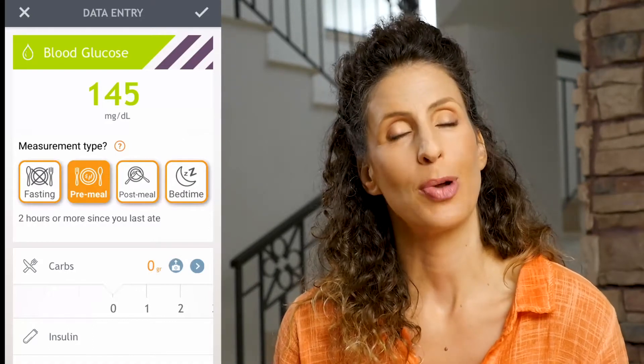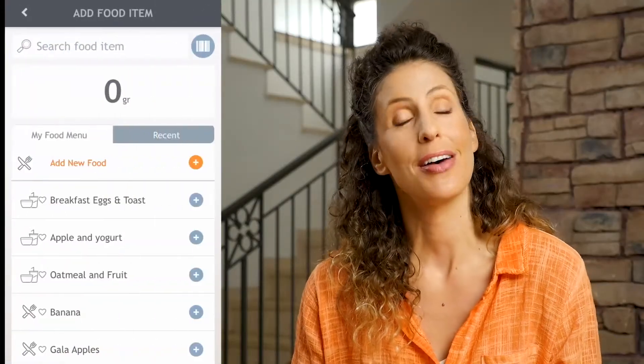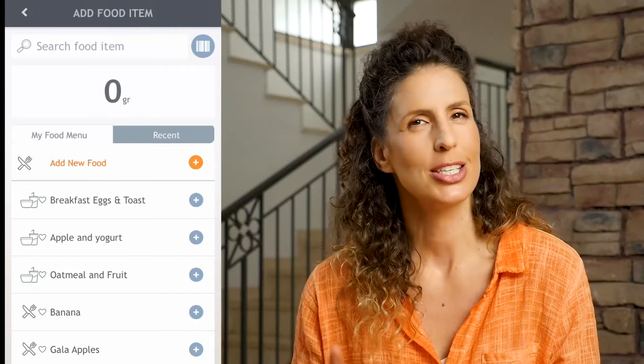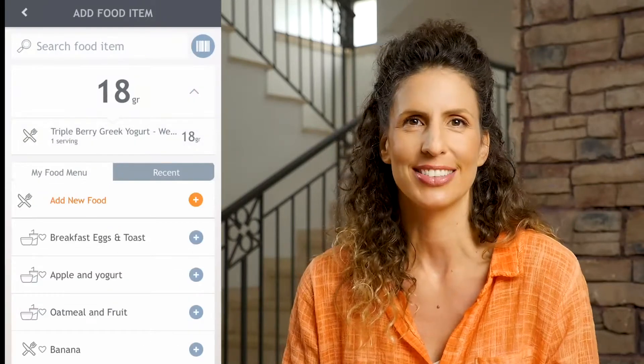Another option is to photo journal your meal by pressing on the gray circle with a camera. This doesn't provide a carb count but it does give you a visual of your portion size and what you ate. To the right, tap on the arrow to arrive at the add food item page. The search bar at the top easily lets you search a food, see its carb value, and add it to your food log.